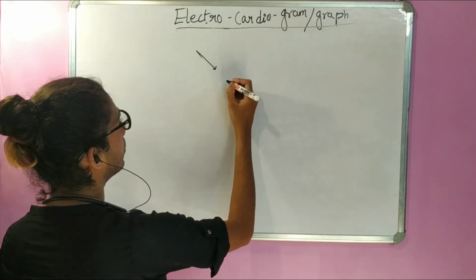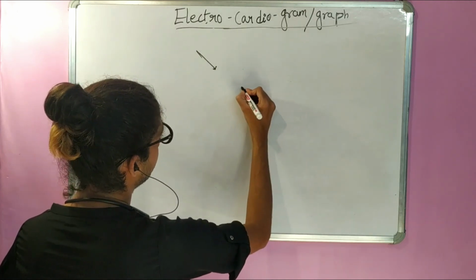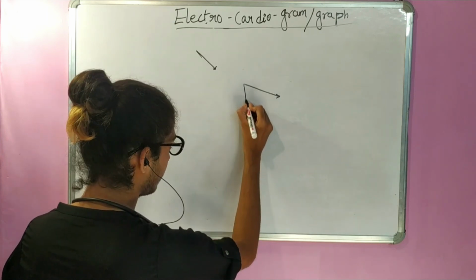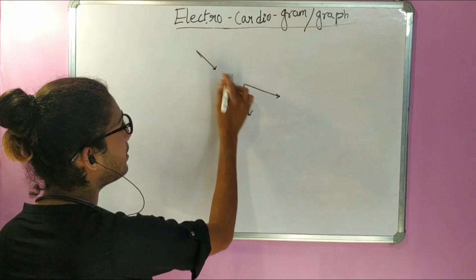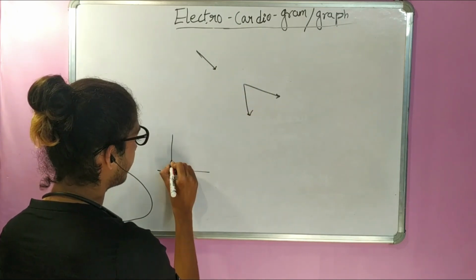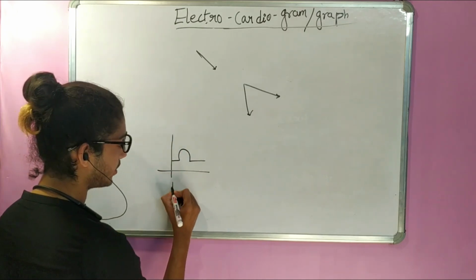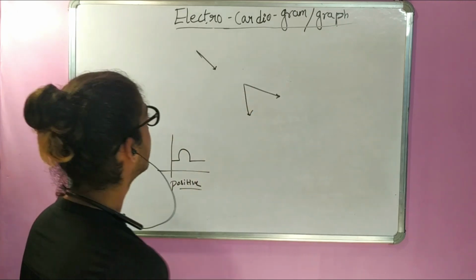Okay, now remember the leads. When lead 2 or lead AVF is sensing it, there will be a positive deflection. So there will be a wave formed which will be positive. So this will sense positive.